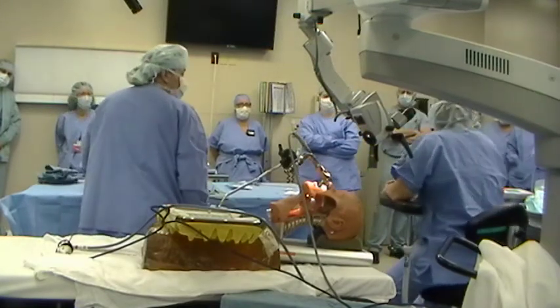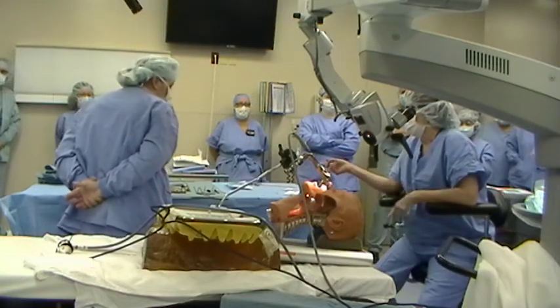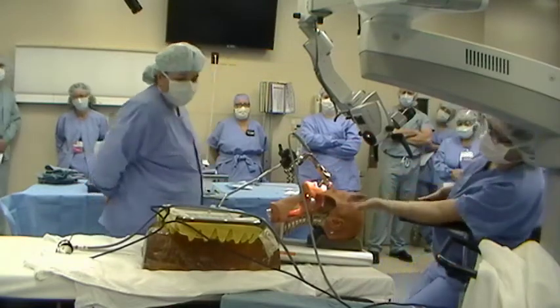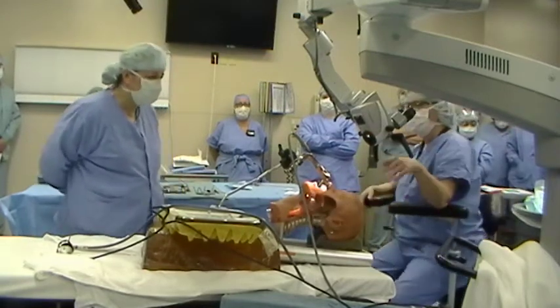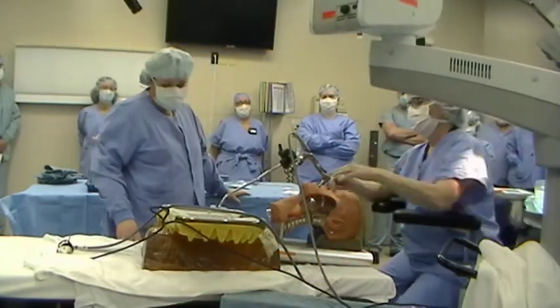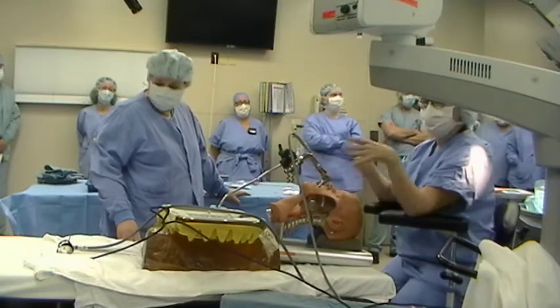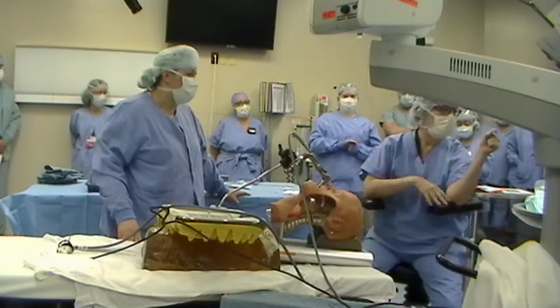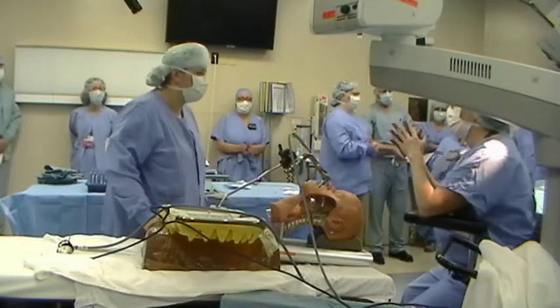Does anyone have any questions? If people want, they can use a cell phone to take pictures. You may want to look over here and see where I'm at down in the throat because the lid is open on this side. At the end of the procedure, I'll just push this out of the way, take the laryngoscope out, check that the lip isn't pinched, and at that point we'll turn the bed back to anesthesia. Thanks for coming, you guys — I really appreciate it. I hope you got some pictures.